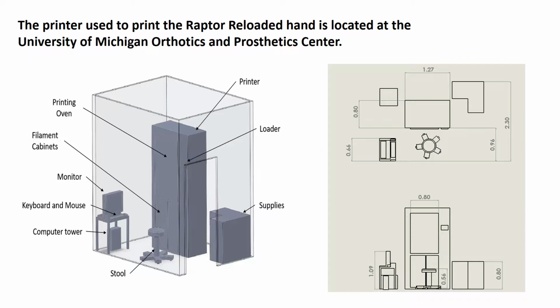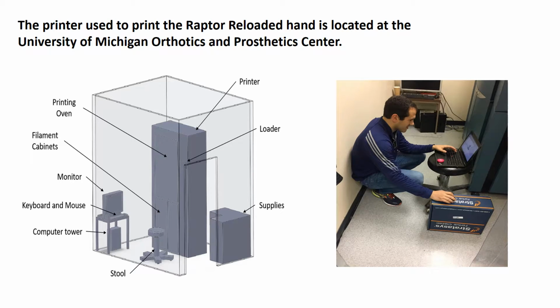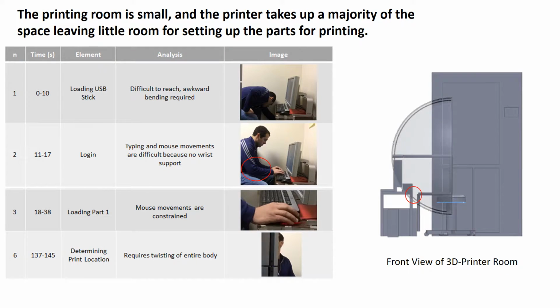The first step in the process is to download and transfer the required part files from a personal computer to the computer controller. However, because there is no extra desk space, less ergonomic substitutes are often used. Upon transferring the parts from a personal computer to a USB stick, the user sits on the stool and rolls to the desk. A methods analysis was performed to record the steps of loading the Raptor parts.